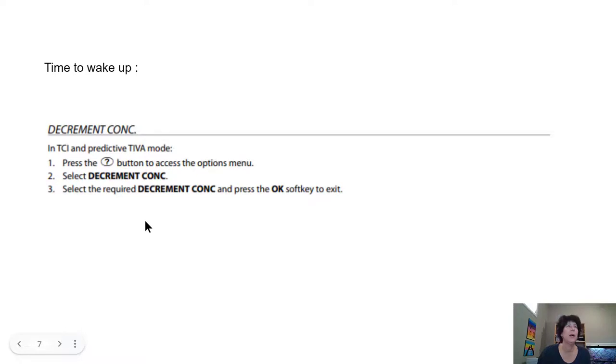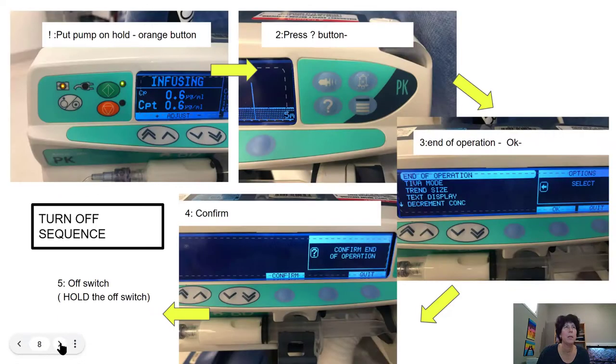The decrement concentration is something we can access through the question mark button on the side of the screen — that takes us to our options menu. That's where you program in the decrement concentration specific to that patient: the CE at eye closure or the stimulation level you're looking for at wake-up. Once you've put that in, a timeline will appear in your pump showing time to wake up. On average that runs somewhere between five to ten minutes when the patient has been asleep for most anesthetics.